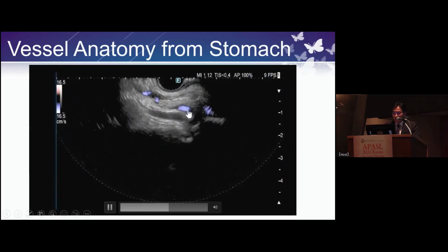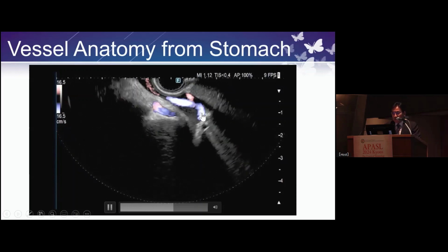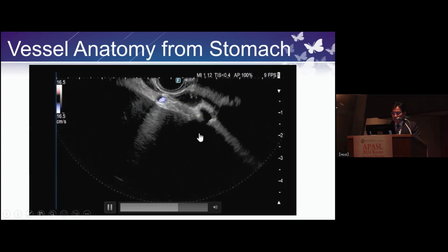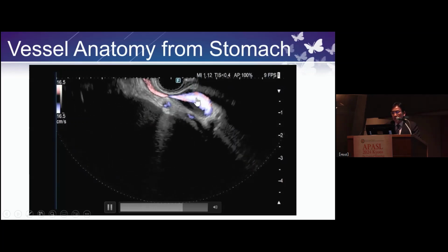I follow the right hepatic artery around the right hepatic hilum. This is a portal vein. This is the anterior portal vein. And clockwise more.